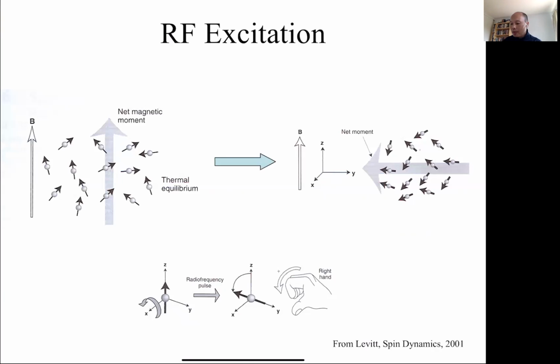The motivation here is similar: let's say you have some object and maybe you just want to image some axial slice. You want to excite a slice and look at its cross-section in very high detail. So you'd like to find some way, instead of exciting all the spins, to excite just a very small section of spins.